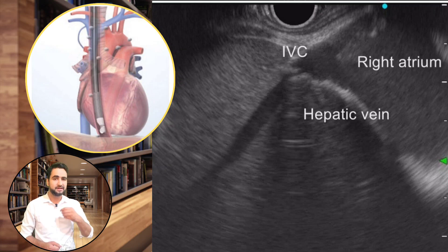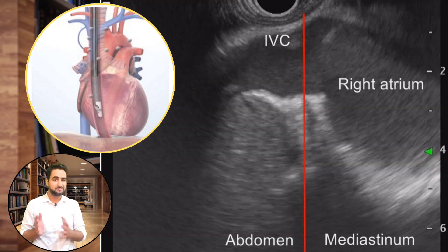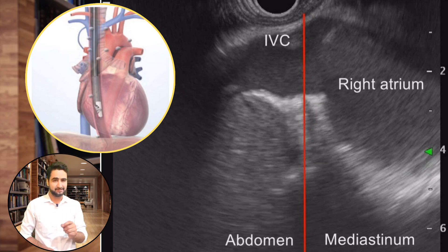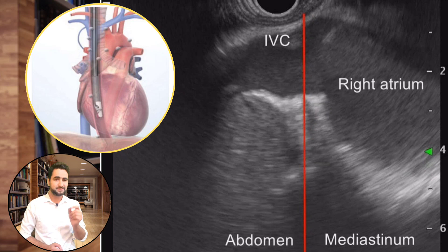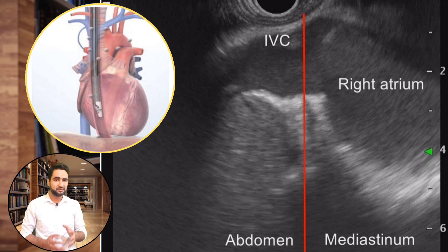Now start following the inferior vena cava towards the superior side while slightly withdrawing the scope. You can observe the inferior vena cava passing through the diaphragm. You can see a vertical red line — this is the boundary between the abdomen and the mediastinum. In other words, it is a boundary between the structures in the range of the tip beam and the structures in the range of the shaft beam. That's why in the EUS image, the mediastinum will be in the view of shaft beams, on the right side of this border.